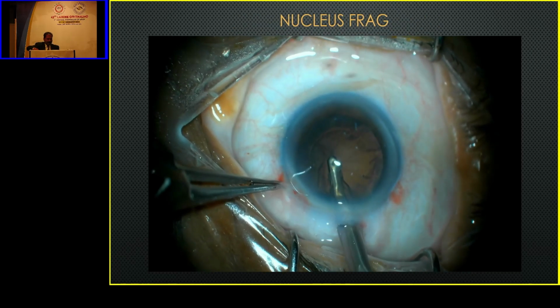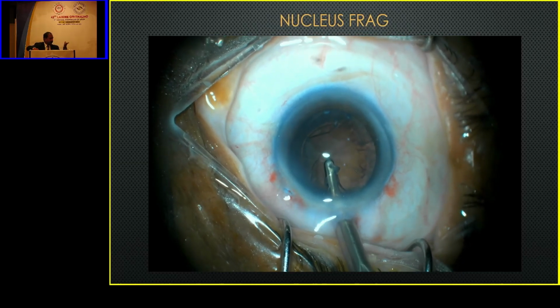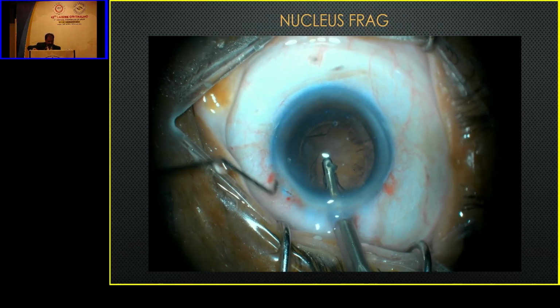So there's a specific setting on the machine for polishing itself. It's a very, very low vacuum. Can we discuss it later on? Will you let me finish this first?